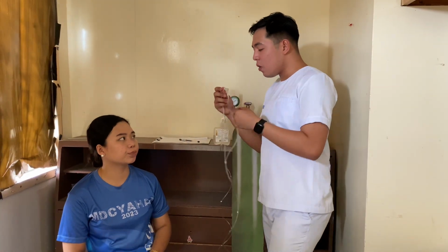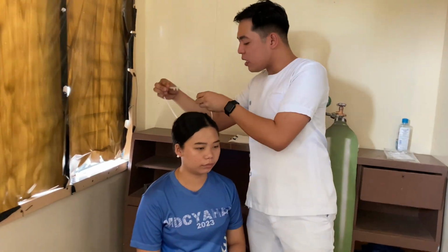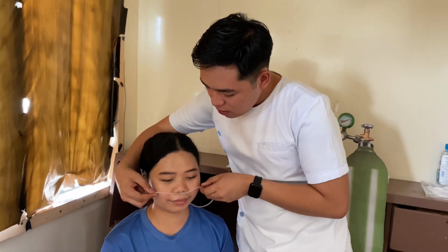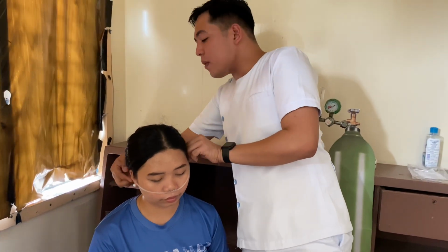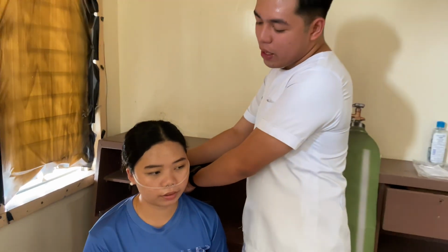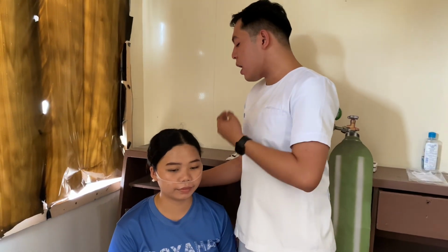So ma'am, I will place the nasal cannula, and it will give oxygen or air to you, ma'am. As you can see here in the back, there's an adjustment where we rely on the patient's comfort. So ma'am, which do you prefer? Tighter or just right? Just right. Is that okay, ma'am? Yes, okay.